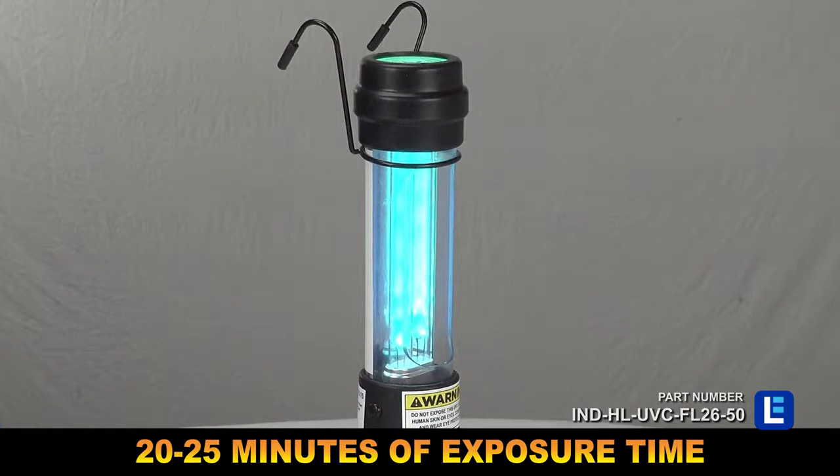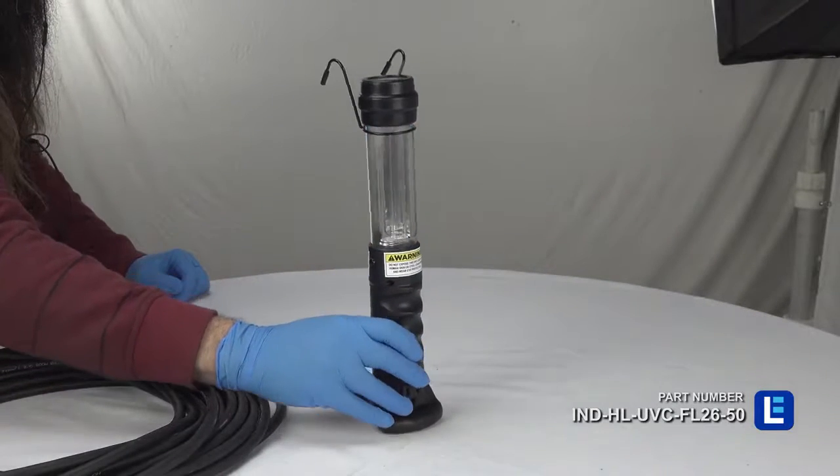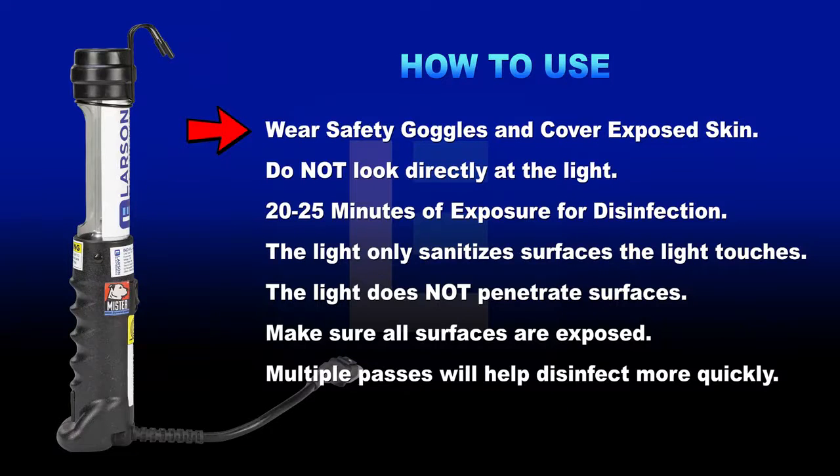Multiple devices can be purchased to cover larger areas more quickly. The ballast is contained within the handle while the housing is constructed of non-sparking aluminum. When using this UV light, wear safety goggles and cover exposed skin — do not look directly at the light. A 20 to 25 minute exposure time is recommended.